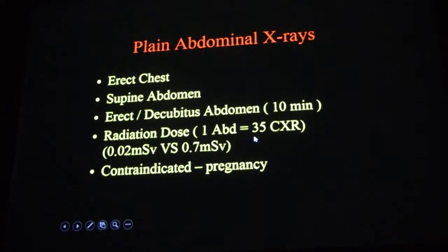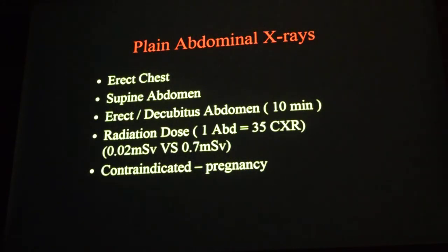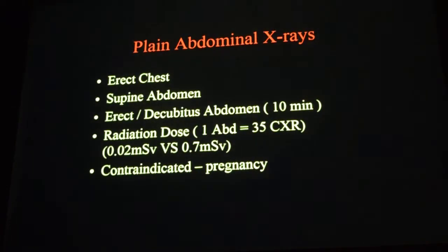Why do you think it is like this? Because there's more visceral surface area. More surface area. Okay, she says there is more soft tissue in the abdomen, so they absorb more radiation. What else? Part of her answer is right, but the main concern is that we determine how the X-ray is done. We give the factors.